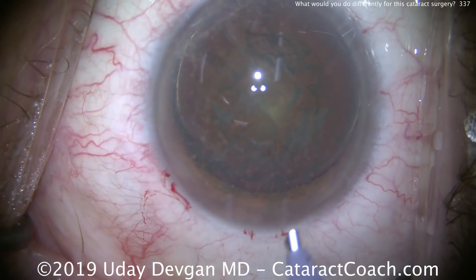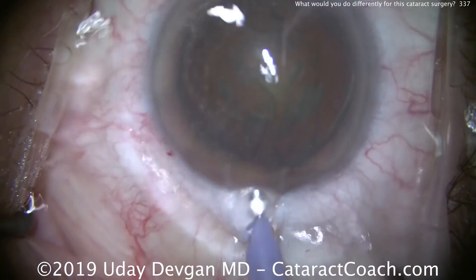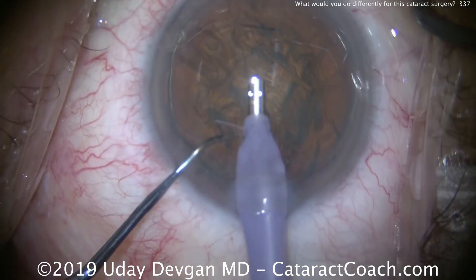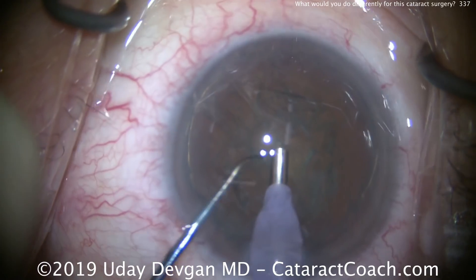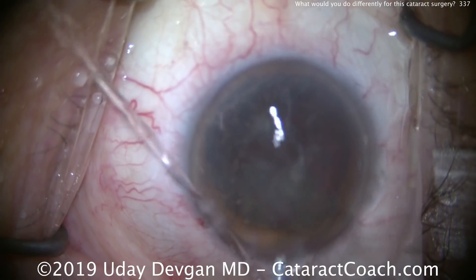For the nucleus removal, I encourage you to use phaco power modulations as well as lower flow settings — run less fluid through the eye. Here I'm going to go into more slow-motion settings. I want to keep the nucleus in the capsular bag, chop it in the capsular bag. I don't want to bring it near the endothelium. So I want to do nucleus removal intracapsular. That looks good.